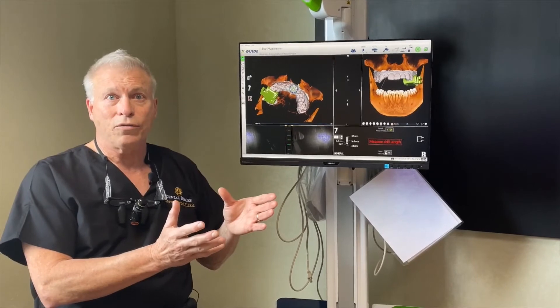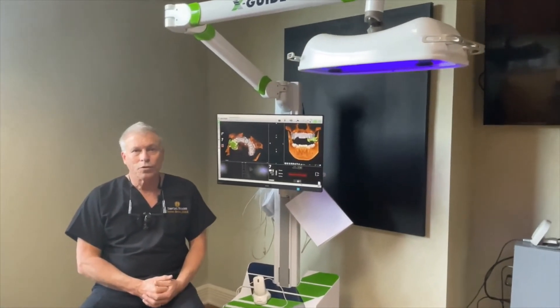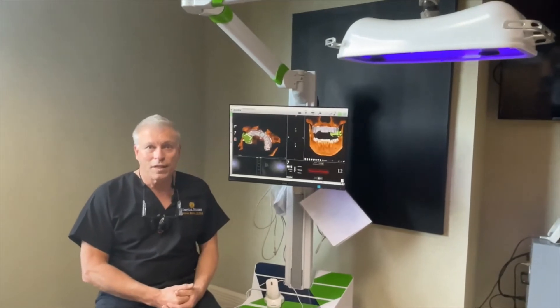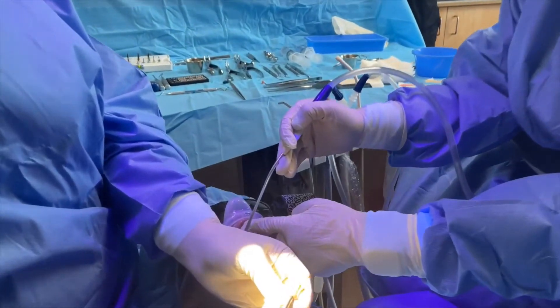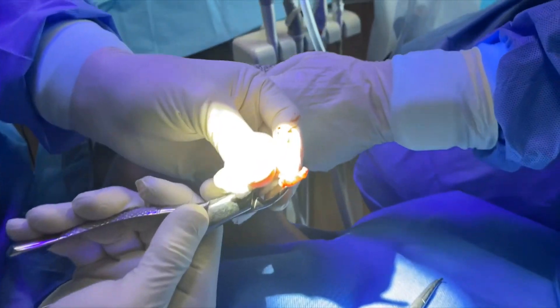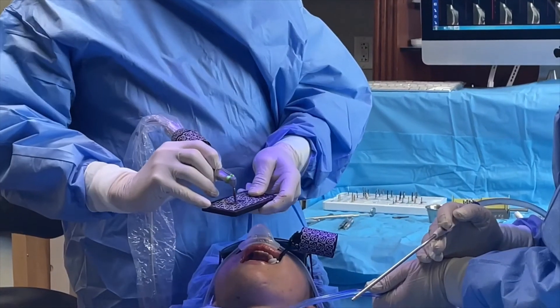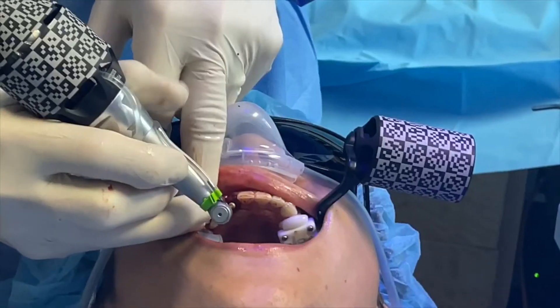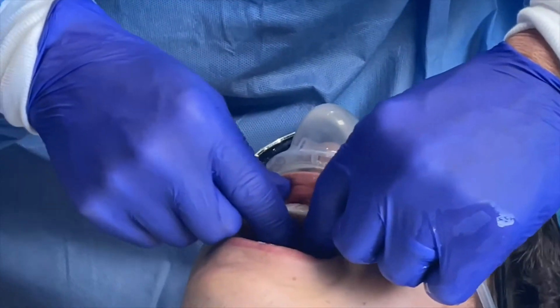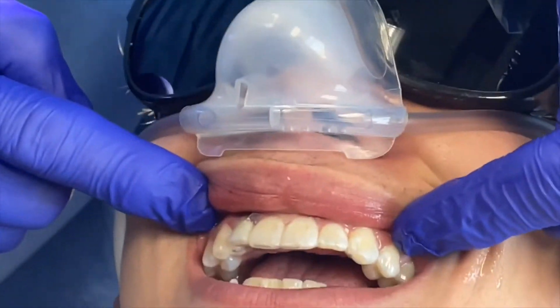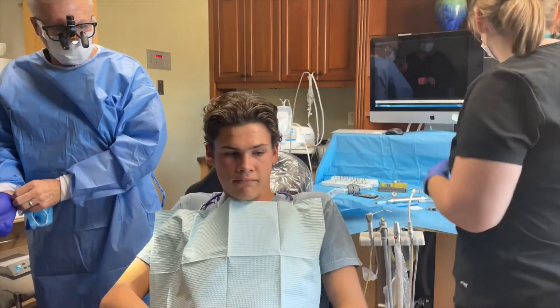With a surgical guide you lose the tactile feedback regarding the density and shape of bone. We had a case today — a young man, a student at the University of Tennessee — who had a previous injury with a tooth that had a root canal, but the tooth fractured and was non-restorable. We also found a cyst associated with the tooth that created pathology needing immediate attention. Using the X-Guide, we removed the tooth and the cyst, grafted the site, and placed an implant in an ideal position so it can be restored to look natural and functional like his original tooth, while preserving all the soft tissue and aesthetics needed for a young man with much of his journey still ahead.